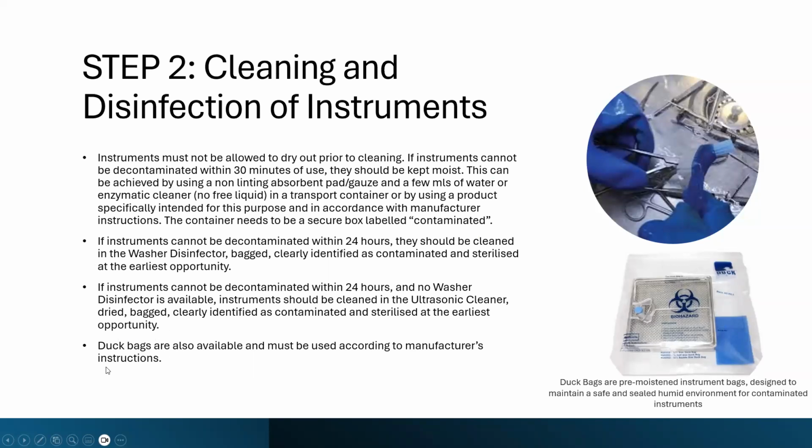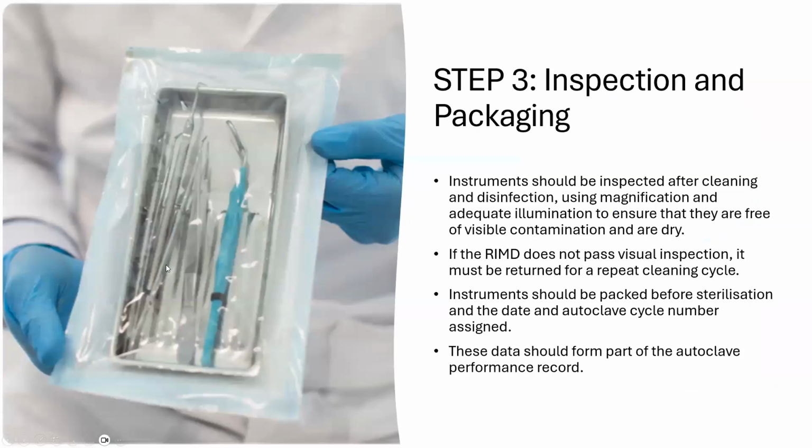Duck bags, these are the duck bags. They are also available and must be used according to manufacturer's instructions. What are these duck bags? Duck bags are pre-moistened instrument bags designed to maintain a safe and sealed humid environment for the contaminated instruments.